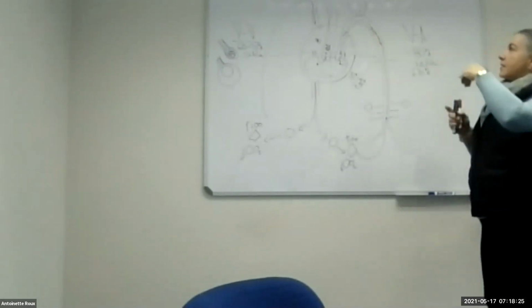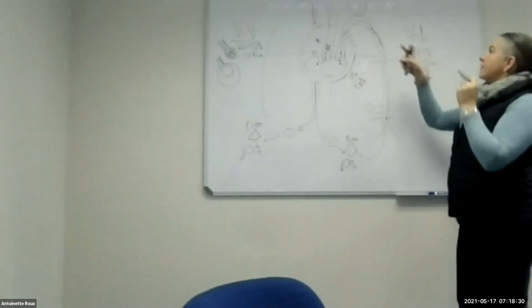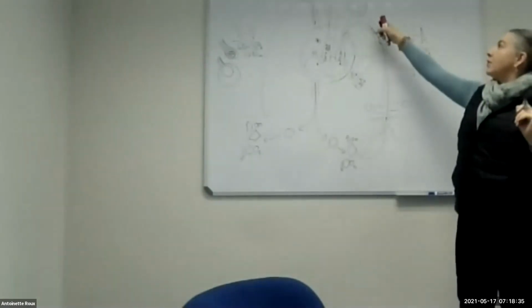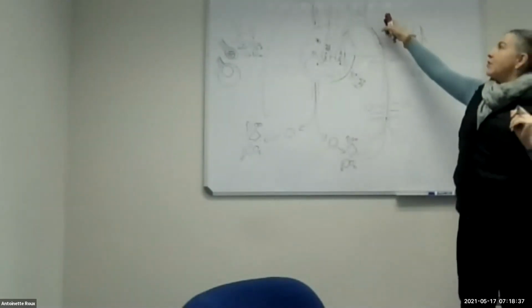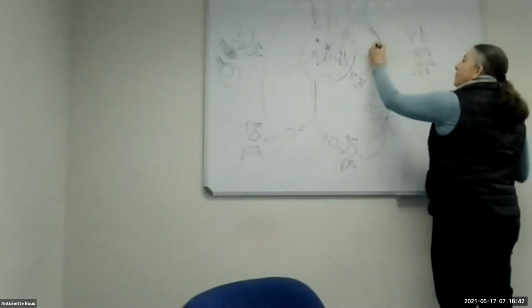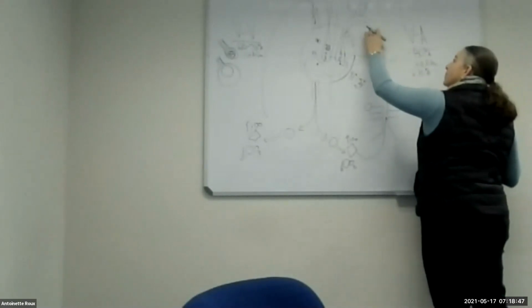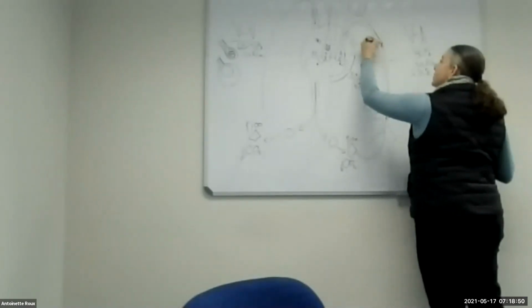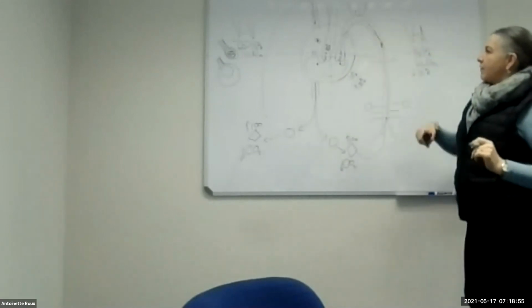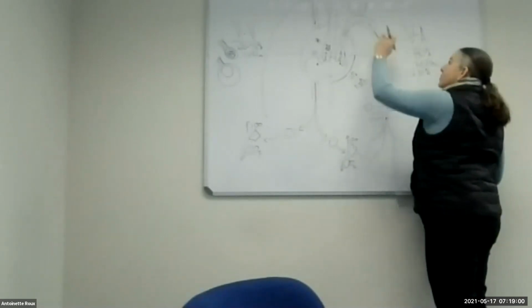So my native heart is coming back, and my machine is working against the native heart. And by doing that, I'm not allowing enough oxygen to the brain or the arms. So you call that Harlequin syndrome, and it means you're depriving the patient of oxygenation to his brain. So we have to come down with our flow on this side to 70%, so that we avoid this and help the patient to get better. And that's how you'll see that your ventricle is improving. It's also to prevent overdistension of your left ventricle. So you have to adjust that very nicely when you're on the VA ECMO.